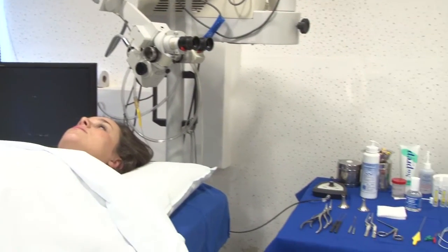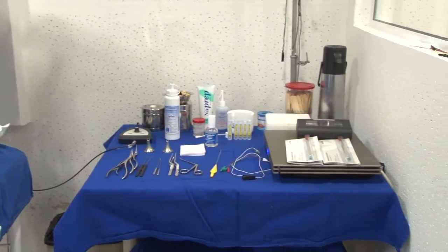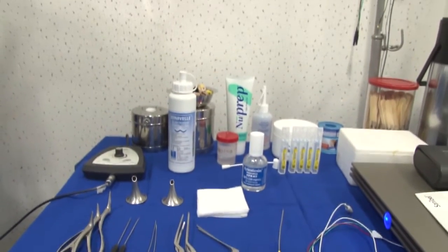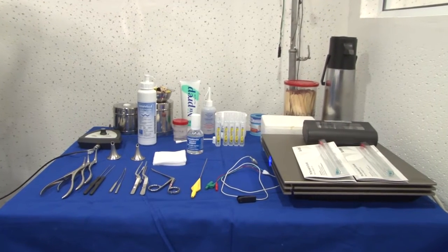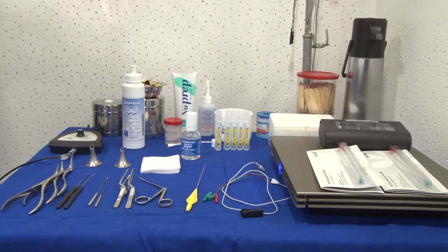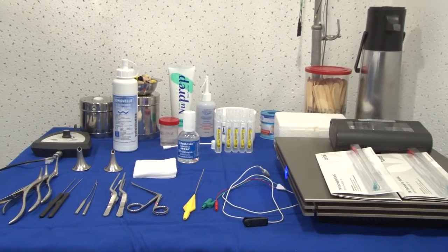Here we show you what we need for electrocochleography. These are the instruments we use for preparing and cleansing the ear canal before the test. You see ear specula in different sizes, curette, alligator forceps, suction tips, straight pick, and nasal speculum.